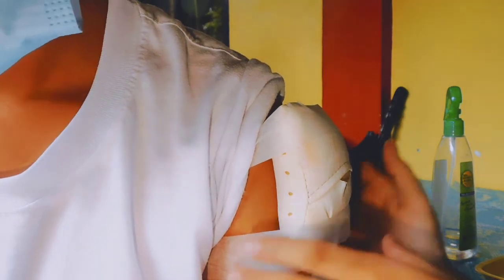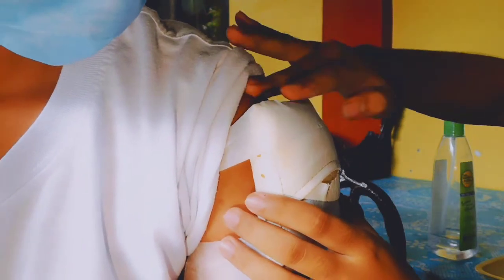Nagkaroon ka po ba ng vaccines dito sa site na 'to? Hindi pa po. Okay, thank you. If injections are to be frequent, alternate sites, so avoid using the same site twice in a row. Locate the exact site for the injection. Here I'm going to locate the acromion process, so two fingers here and two, so it's right here.